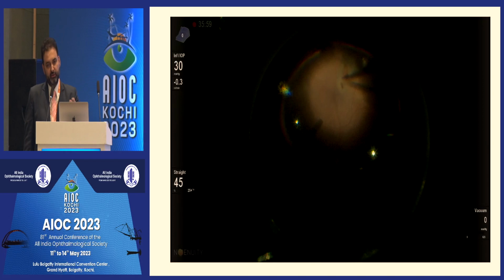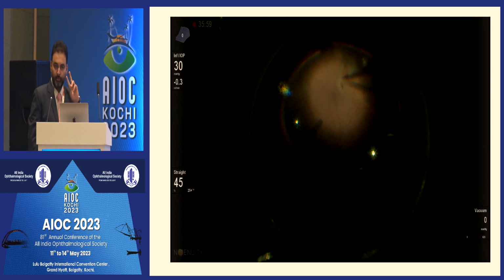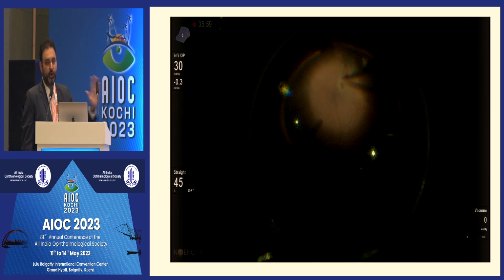So coming to the discussion of the second case, subretinal silicone oil, I'm just going to make 2 points, pose one question, and then go on to the next case, and then maybe we can have some discussion later on. Unlike PFCL going underneath the retina, where you tend to get smaller amounts, possibly multiple bubbles, fish egging, you would notice that during surgery. Oil will be a jet stream which will go in, which is a decidedly rarer phenomenon.